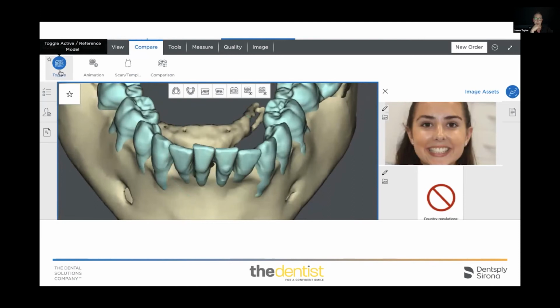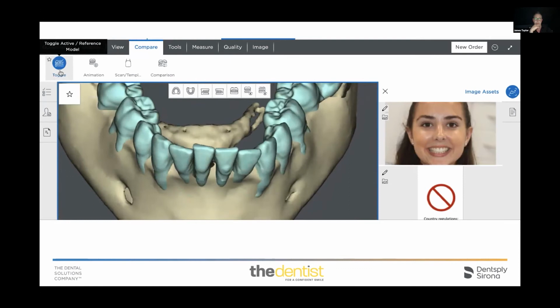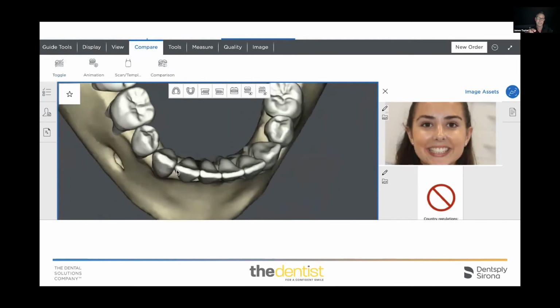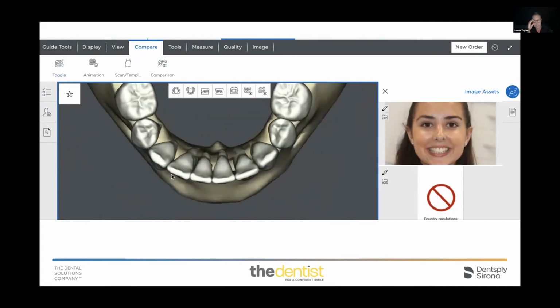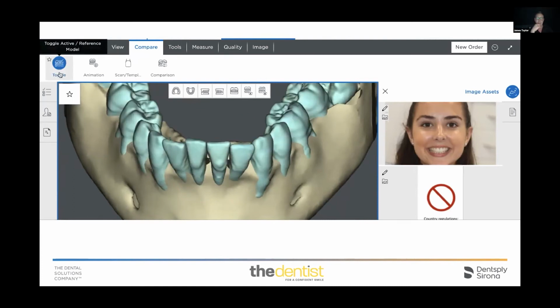Again, you can see now as I'm looking how those teeth are going to be put into a much better position within the bone and hopefully reduce that amount of recession. And so this demonstrates how and why I'm using CBCT more and more. As well as anyone can align teeth virtually. That's easy to do. You can do it on a screen.